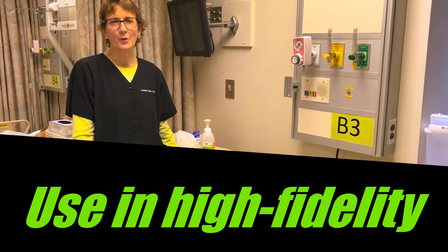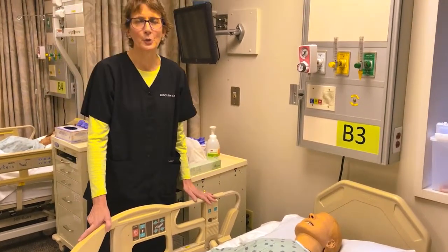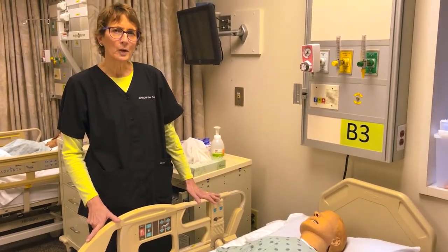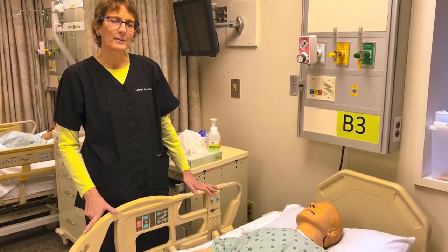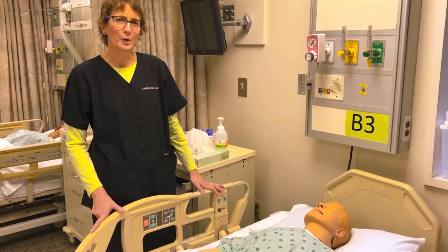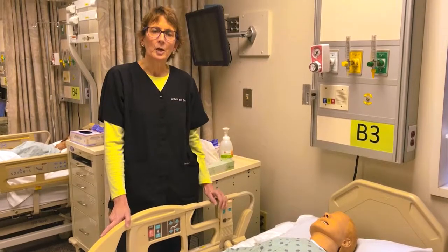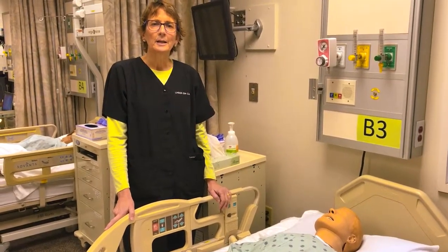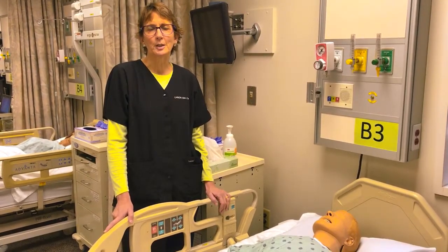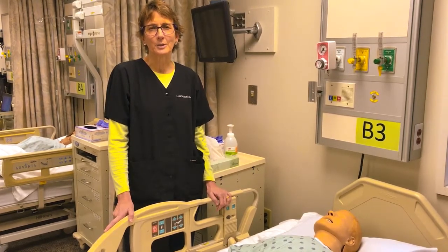Another potential use for the simulated IV bypass system is with high fidelity or advanced mannequins. And although these mannequins do have IV capabilities, depending upon your objective, you may want to bypass the mannequin's vasculature system in order to save time and also wear and tear on your mannequin. By using the simulated IV bypass system, you save on punctures to the mannequin's skin, potential damage and real damage to the vasculature system, and the various backflow regulators that are part of the mannequin's internal system.